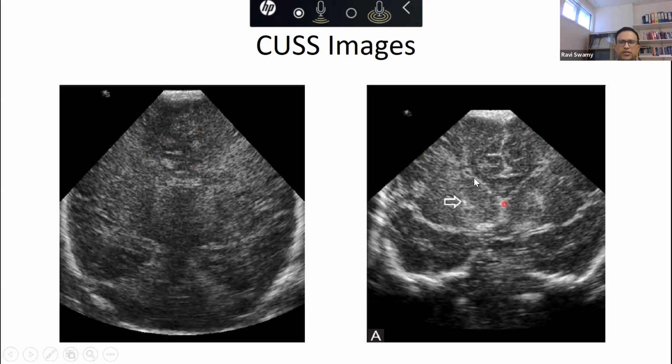The second thing I told you is the BGT lesion. BGT lesion is basically your basal ganglia and the thalamus, which will come in this area. And as you can see, you are seeing an increased echogenicity. So here you see it's just dark. This one has cerebral edema, but there are no BGT lesions. Whereas here, this child has no cerebral edema, but you can see some increased intensity from the basal ganglia area. So this is the crude way.